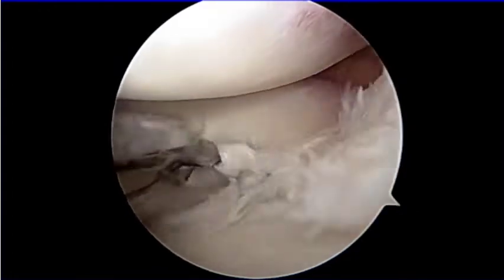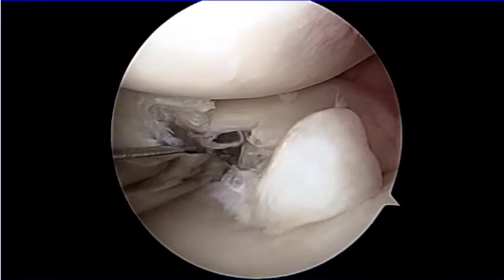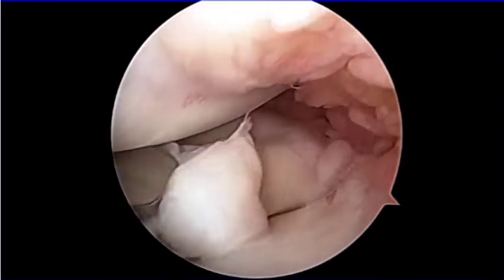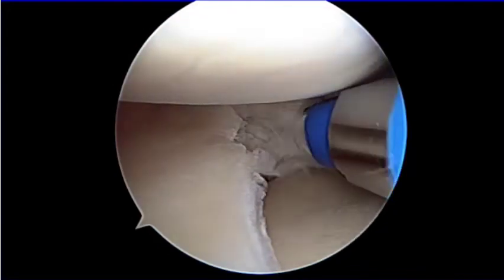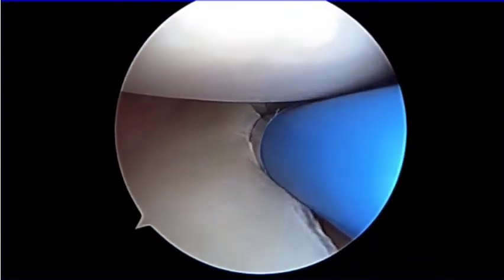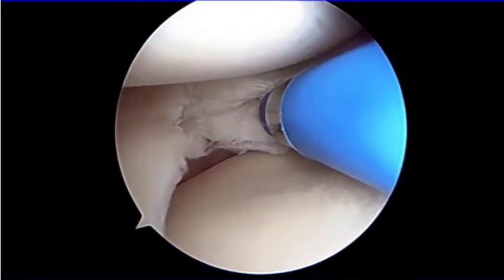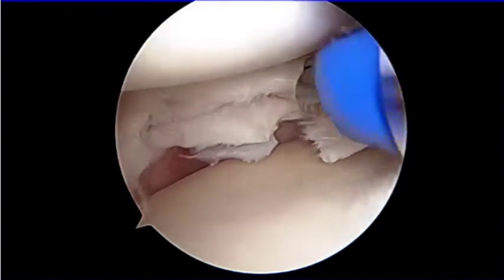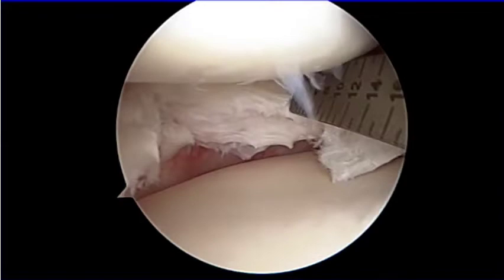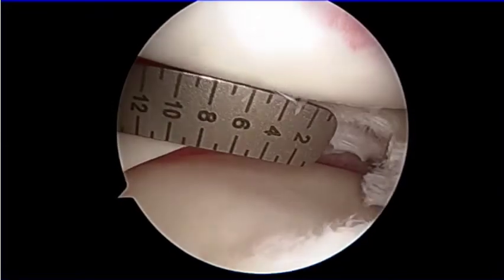A partial meniscectomy was performed in the degenerative area by using an oval punch and shaver. The defect size was 14 mm of depth and 16 mm of width.